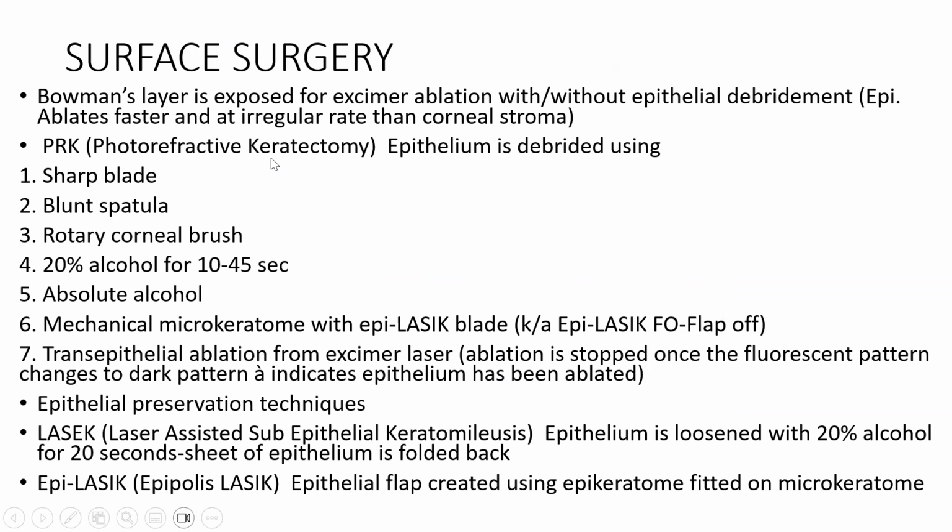So basically in surface surgery, the Bowman's layer is exposed for excimer ablation with or without epithelial debridement. The point to note here is that epithelium ablates faster and at an irregular rate than the corneal stroma.